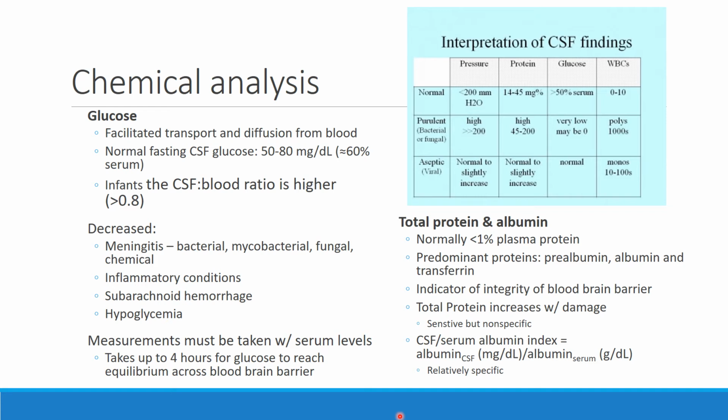These methods are used because they're more sensitive to lower levels of protein. But no one of them will be able to detect every single CSF protein. So a lab has to choose the one that they think will most represent the situation that they have.